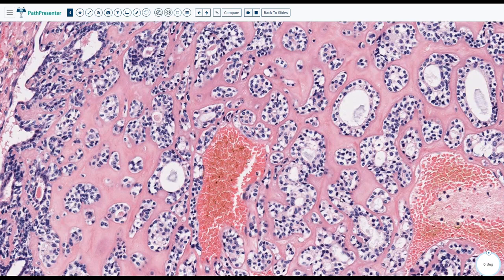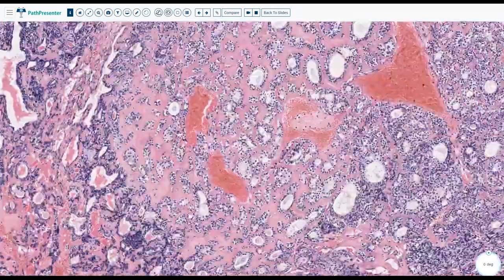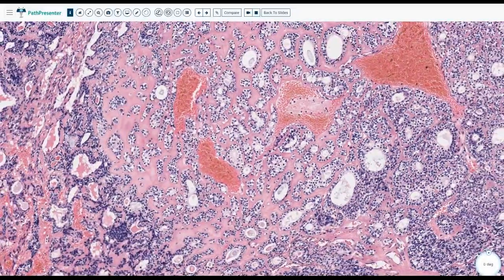So usually myoepithelioma will show mostly myoepithelial cells, and actually we have a case. So let's discuss that, Chris, when we get into it. Myoepithelial cells can have different phases, faces. I mean, you will see spindle cells, you will see plasmacytoid, you will see hyalinized like this. So it is not an easy question. It can again be clear cells. When you see this biphasic proliferation like this, it is kind of characteristic. It is the epithelial myoepithelial carcinoma.